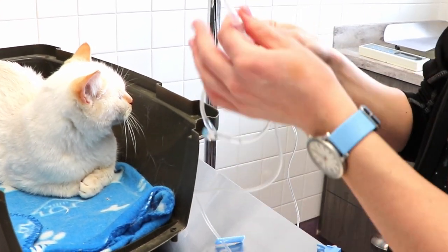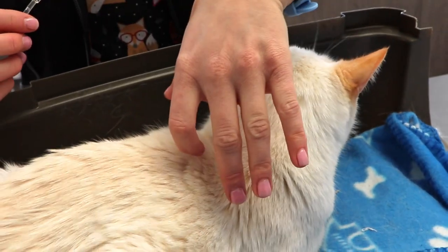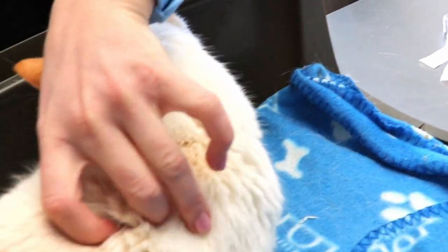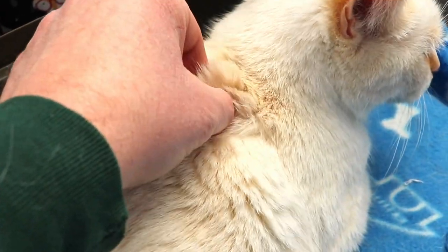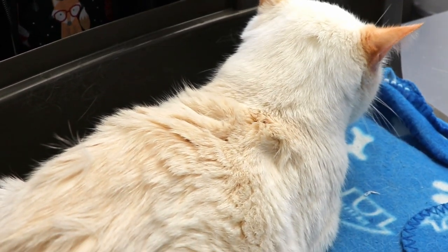For where to give it, we usually do just in this area, so just kind of like you can pinch the skin around here — just kind of between the shoulder blade area. Have you ever given a subcutaneous injection or anything like that before, or no?